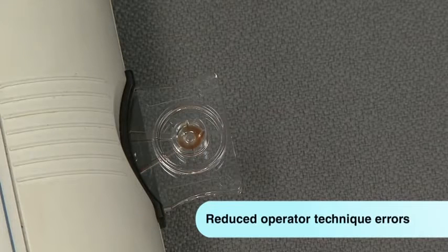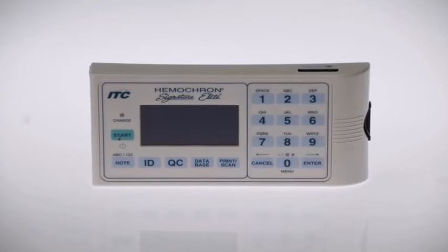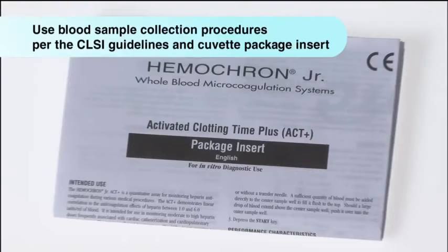When the start button is pressed, Elite automatically draws exactly 15 microliters of blood from the sample well into the test channel. Excess is drawn into the waste channel, reducing biohazards. Errors due to operator technique are reduced because the instrument draws the precise amount of sample needed. Remember to follow whole blood sample collection procedures per Clinical and Laboratory Standards Institute guidelines and the Hemocron Cuvette Package Insert whenever you perform a test using Elite.